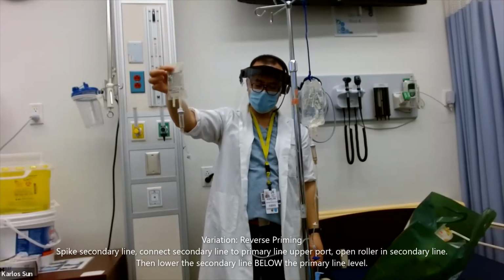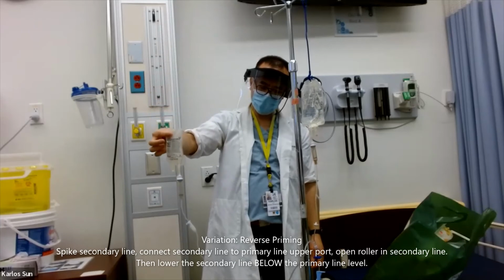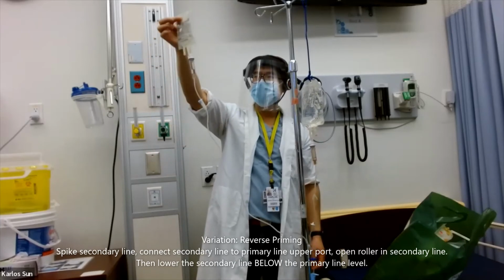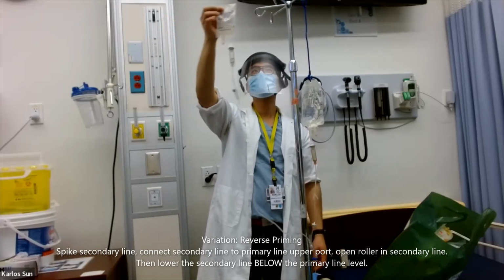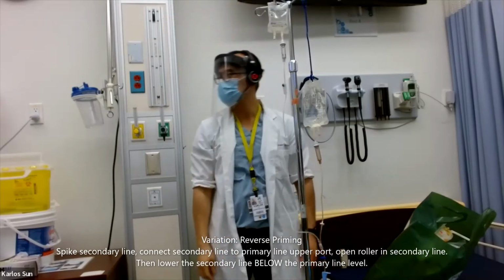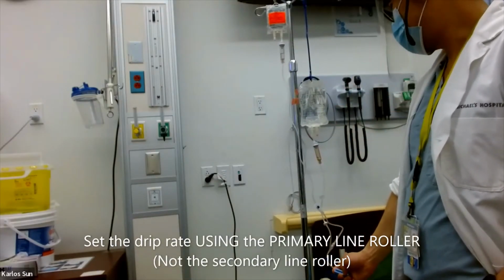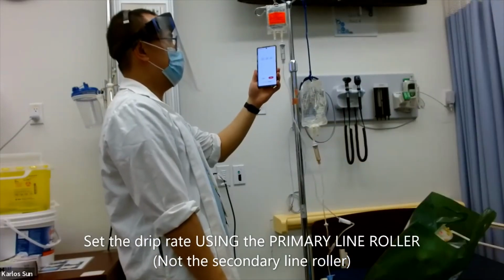Now all you have to do is lower the secondary line below the primary, and the primary line will prime the secondary line backwards, hence the name reverse priming. Now you set the drip rate using the primary line roller, not the secondary line roller.